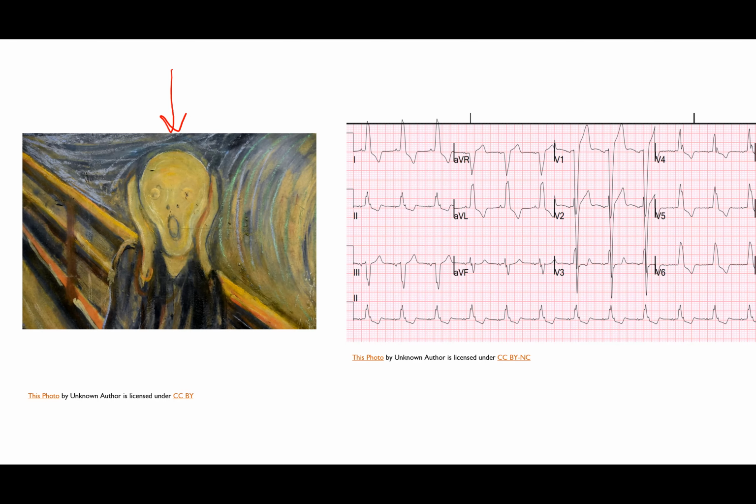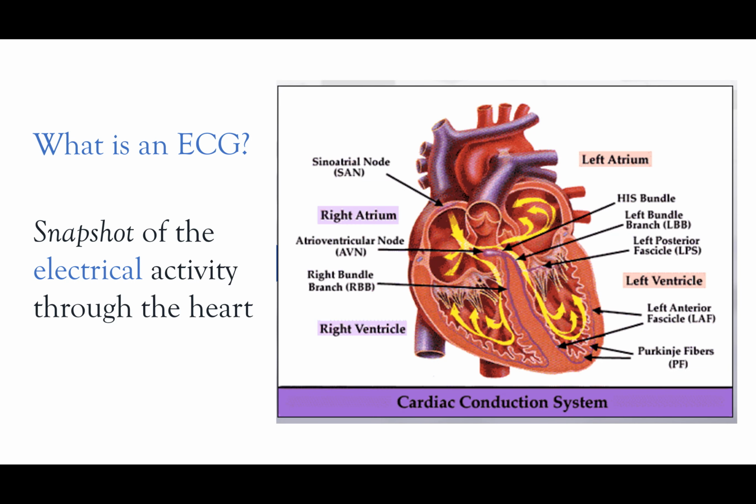So the question is, how do we go from something super complex and break it down to something that's readable and understandable? So in order to do that, we need to first understand what an ECG actually is.